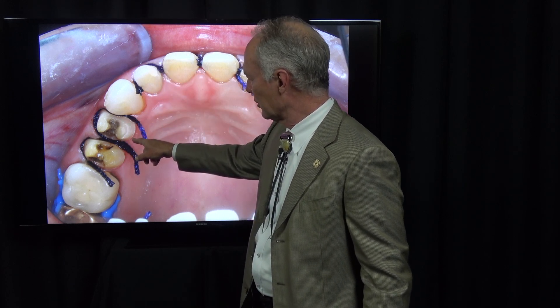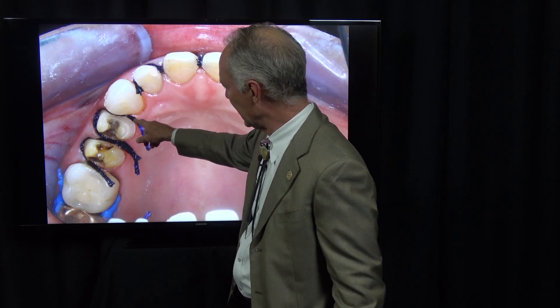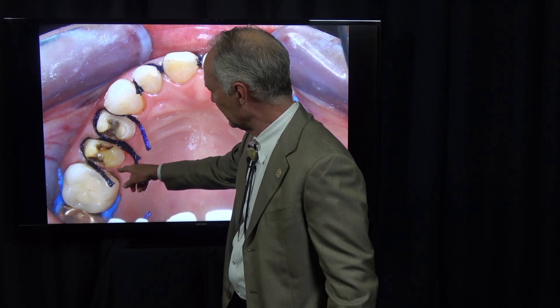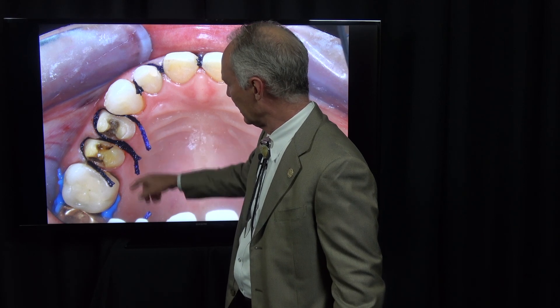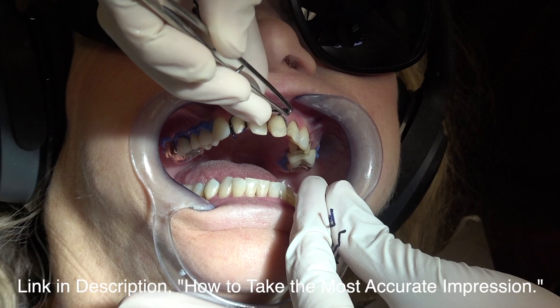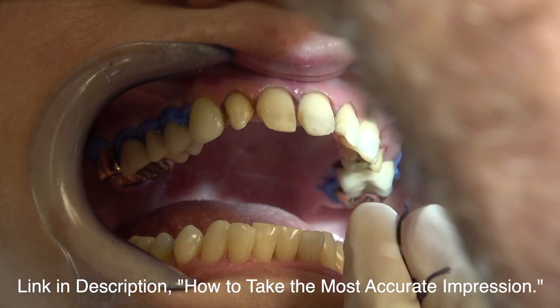On the full crowns, the cord is just lightly in the interproximal and not at all on the palatal, because I have supragingival margins on the palatal. We're going to talk about the full crown preps in a minute.